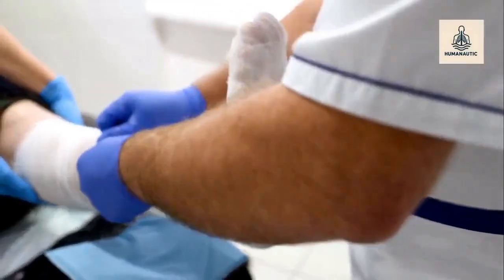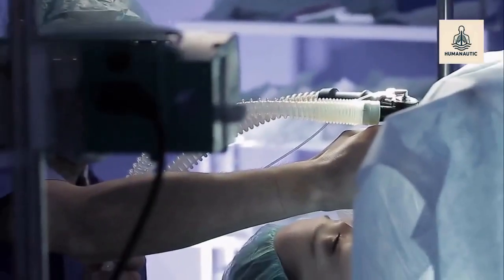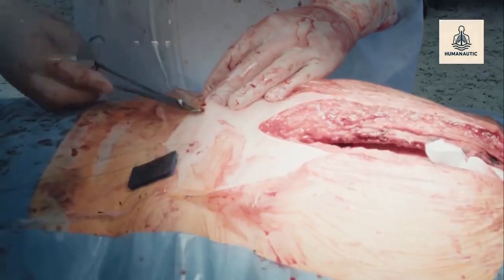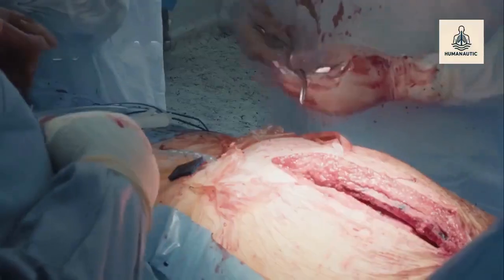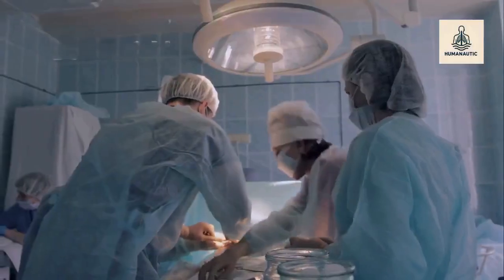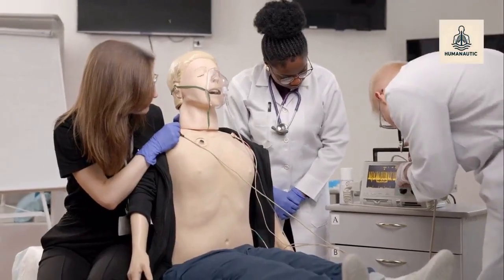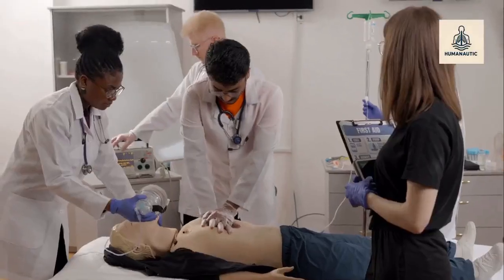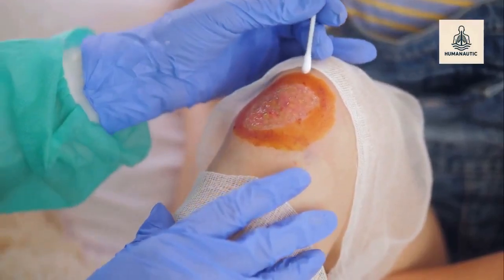Why is wound debridement important? Debridement is important because it reduces infection, improves blood supply, promotes healthy granulation tissue, enhances the effect of antibiotics, and prepares the wound for closure or grafting. This is especially important in diabetic foot ulcers, pressure sores, traumatic and infected wounds.